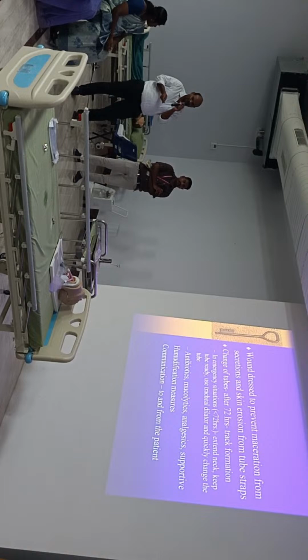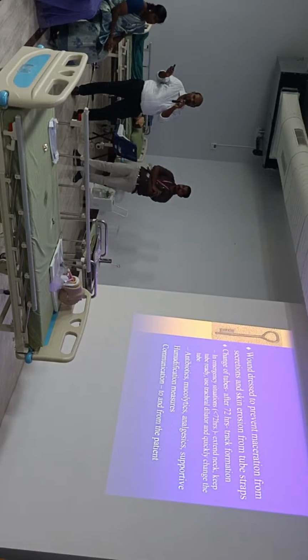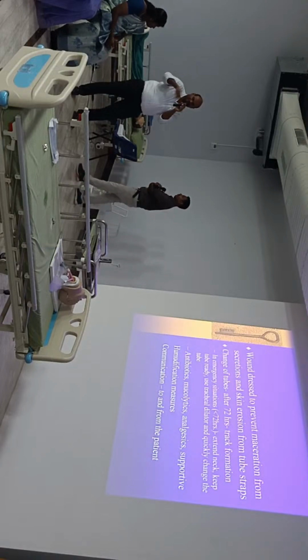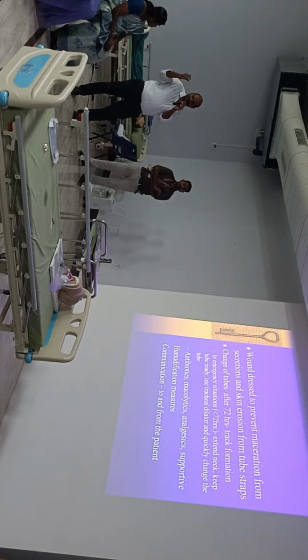If the tracheostomy tube is blocked and that is the only tube there, what other tube will you have in your emergency crash cart? In your emergency ward, there will always be a crash cart, which will definitely have endotracheal tubes of whatever size. So just dilate the stoma, and you can always put an endotracheal tube till we can put the tracheostomy tube back. But put a smaller size tube. That will help you in putting the tube easily rather than a bigger tube.